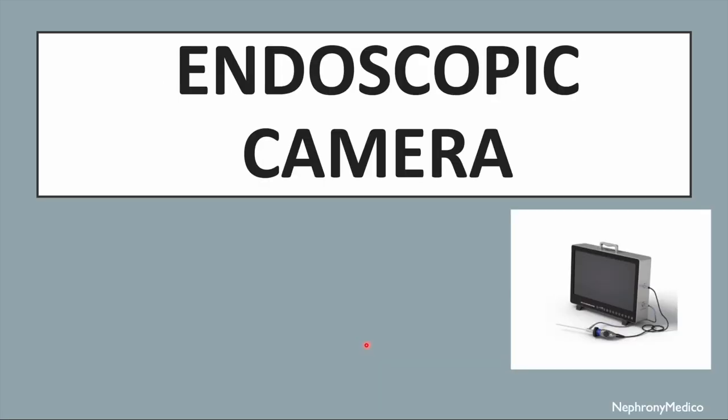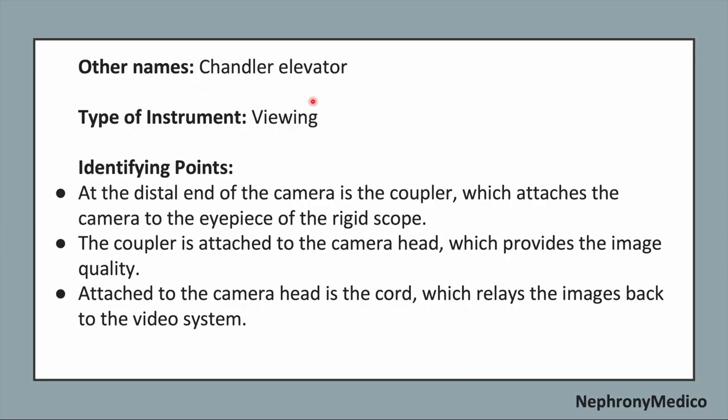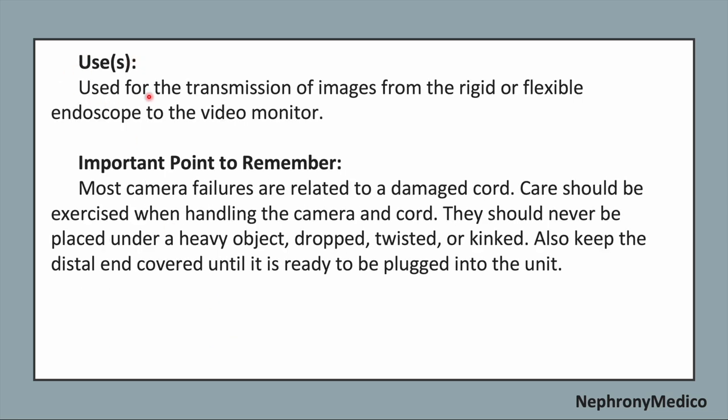Let's talk about endoscopic camera. This is a picture showing an endoscopic camera. It is also known as a viewing instrument. And identifying points include, at the distal end of the camera is the coupler, which attaches the camera to the eyepiece of the rigid scope. The coupler is attached to the camera head, which provides the image quality. And attached to the camera head is the cord, which relays the images back to the video system. Use. It is used for the transmission of the images from the rigid or flexible endoscope to the video monitor.